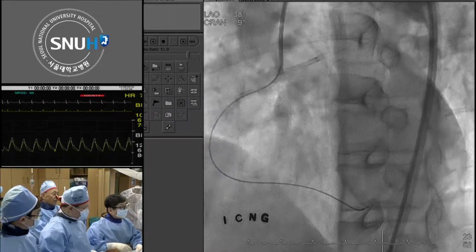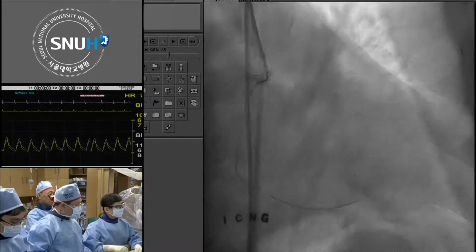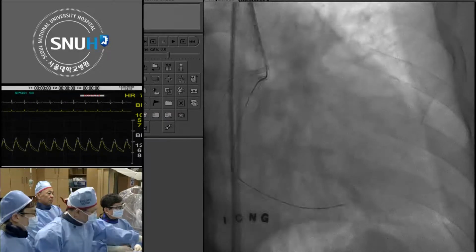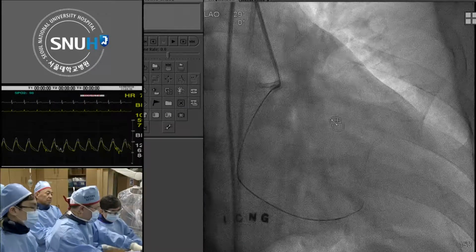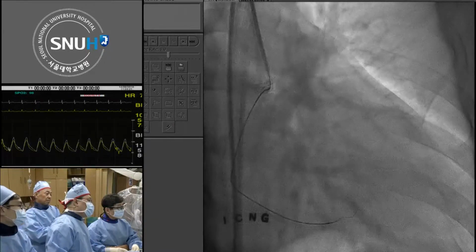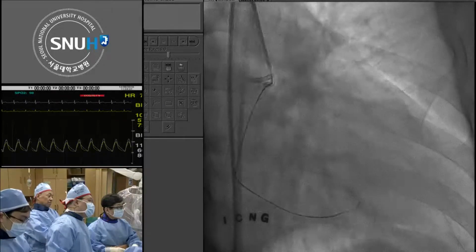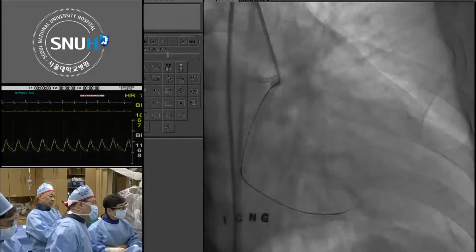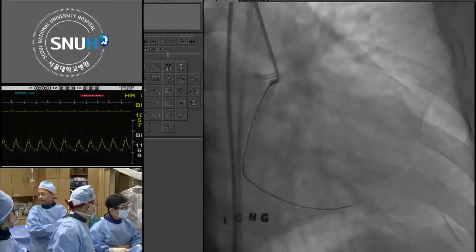Professor Kim, I have one question for you. Dr. Finkelstein, Ariel, when would you switch? I mean, we recommend the hybrid method in the US. You try retrograde, and I probably would have shifted to antegrade at this point. In your experience, when would you switch from retrograde to antegrade? Well, it's very difficult to stop a procedure at that stage because right now it looks like he's doing a very good job. The only point is that either he goes to another septal or he needs to make a strong bend in the septal that he's chosen.